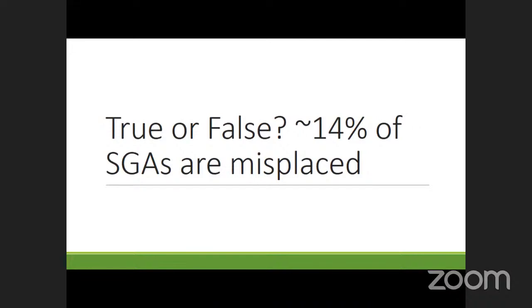True or false, 14% of LMAs or supraglottic airways are misplaced by EMS. Realize that this is approximate. Obviously, if it's 15 or 16, I'm not going to try to trick you. Who thinks the statement is true?